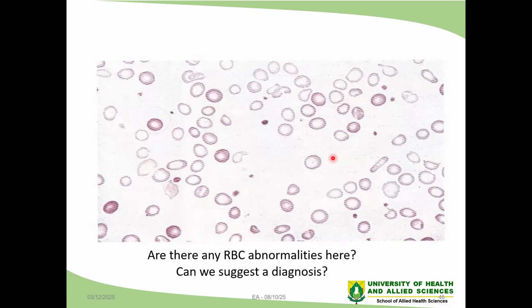If you look at a lot of the blood films that I was showing, you could see that at least there were a number of red cells in the blood film. But in this case, you could see that they are markedly reduced, and that's a clear sign of anemia. Secondly, the majority of the cells we have here are hypochromic in terms of their hemoglobinization.